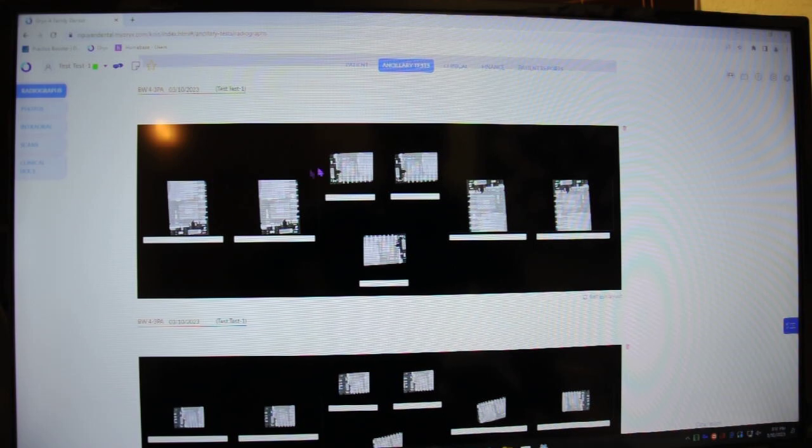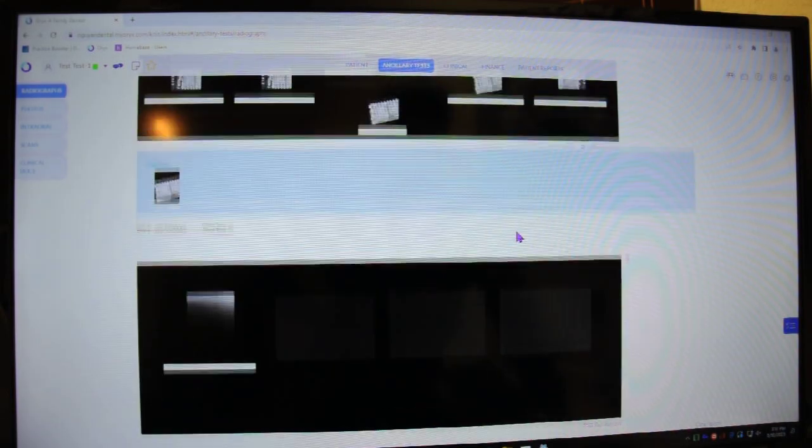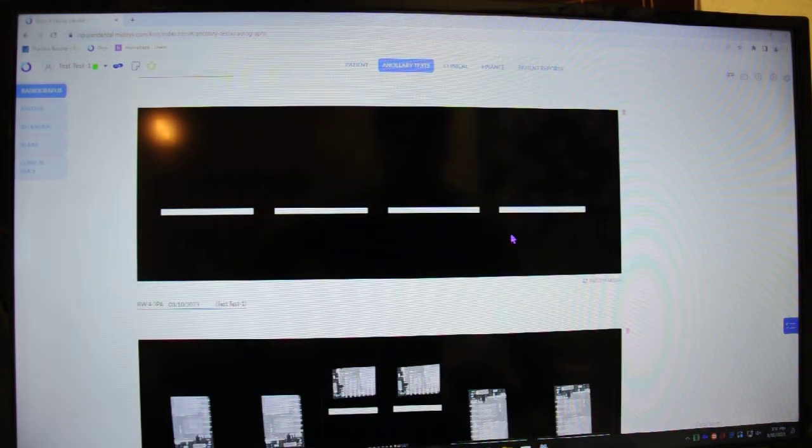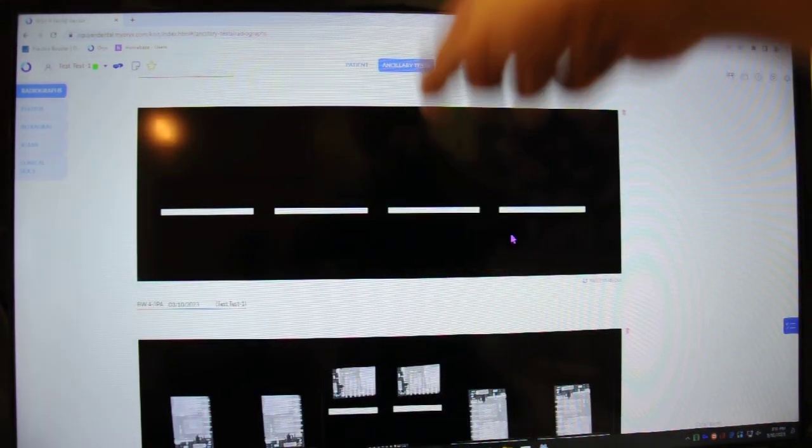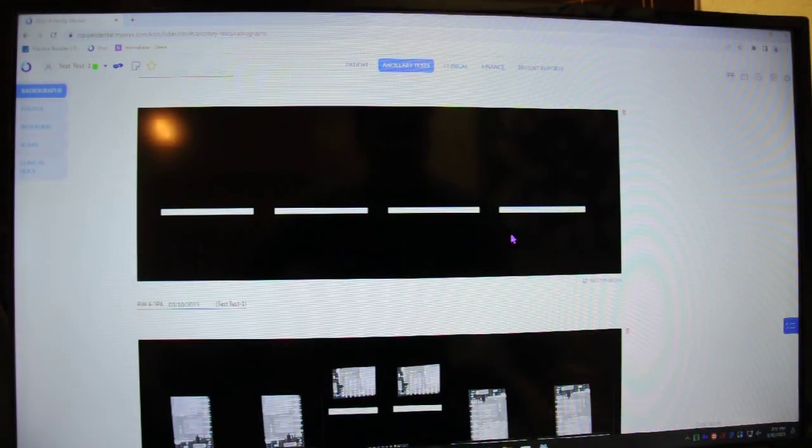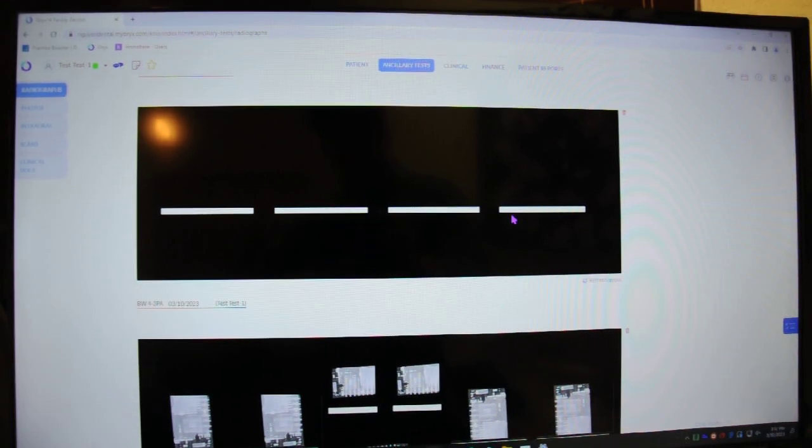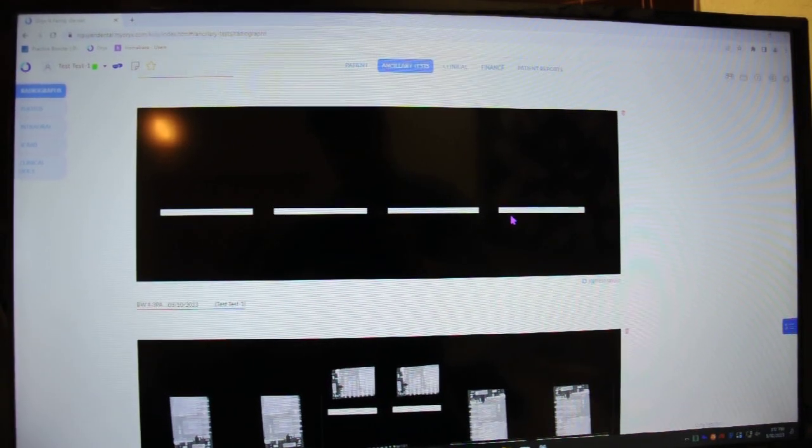The four bite wings, three PAs. You can tell I've been shooting some X-rays there. I'm not sure where this four bite wing layout came from. I might have just hit that before I closed it out. Okay. That's it.